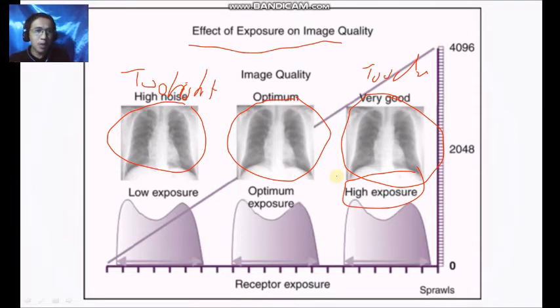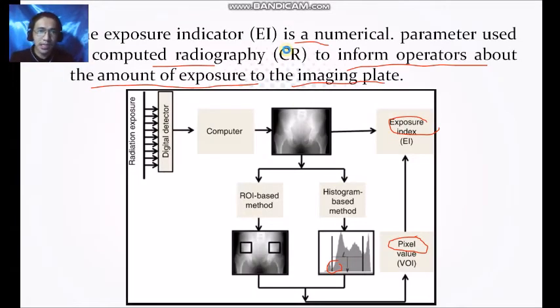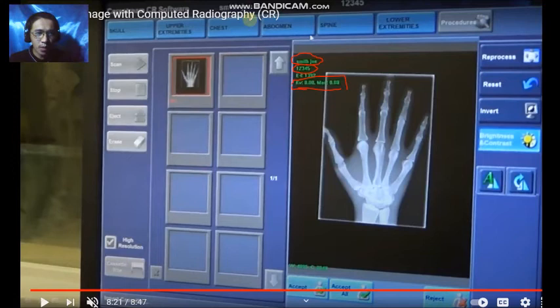So there can be no problem if the rad tech picks the chest exam. In setting up the examination in the computer, the rad tech pressed this before he inserted the cassette. So chest was picked by the rad tech, and then during the exposure, the factor was too high, so the patient was overexposed, the film was overexposed. Okay, so there's no problem with that.